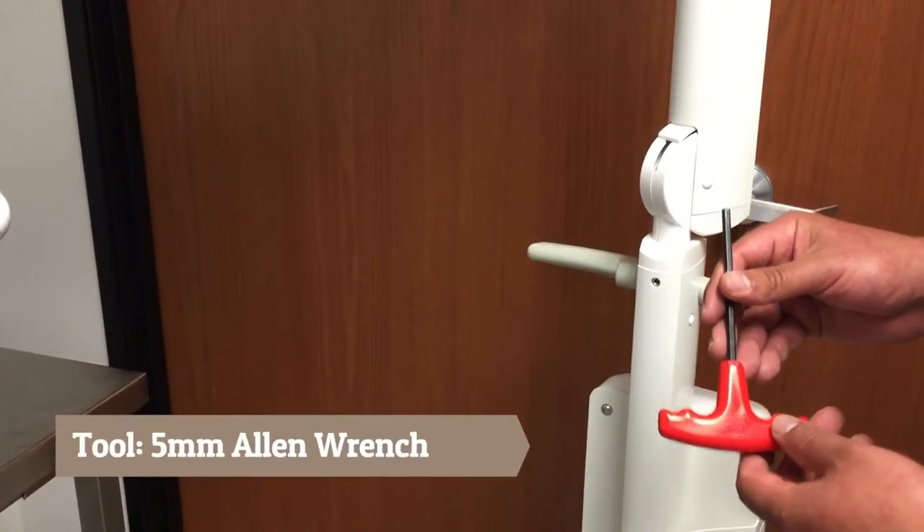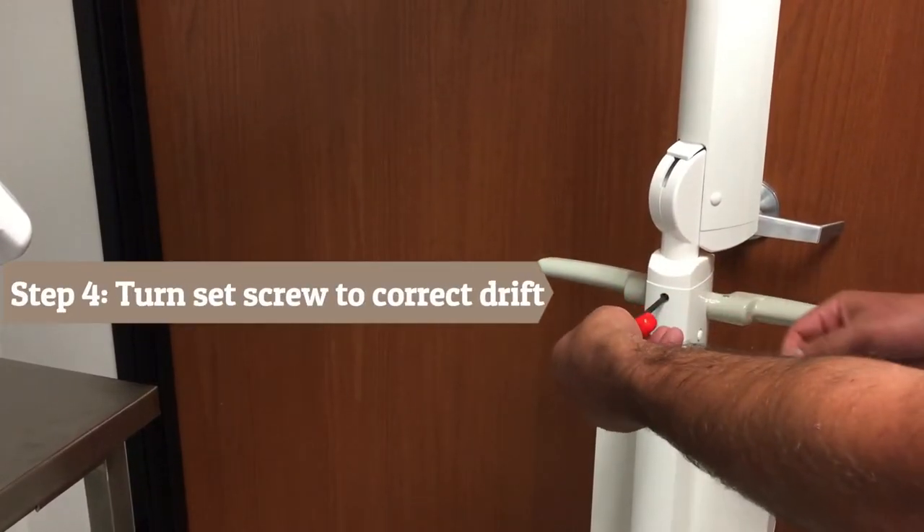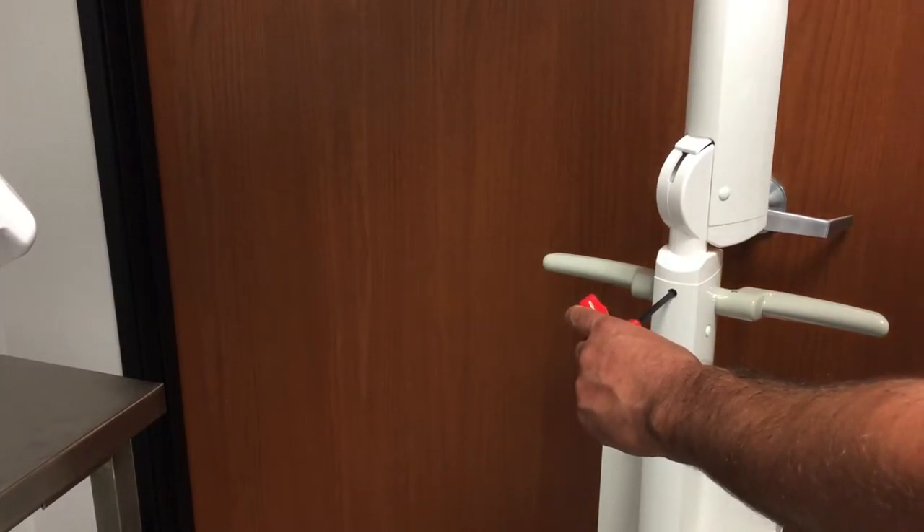Step 4: Using the 5mm Allen wrench, turn the set screw clockwise to put more tension on the scissor arm to correct the drift.